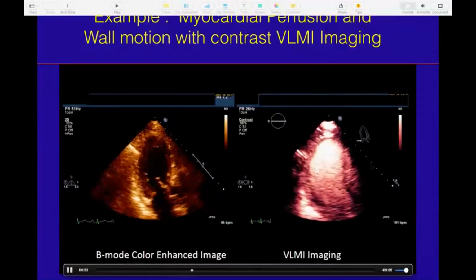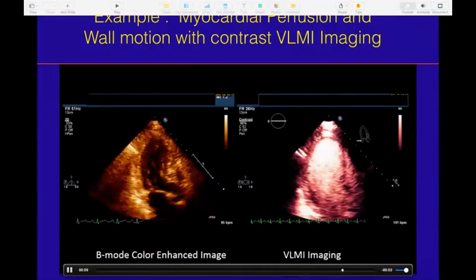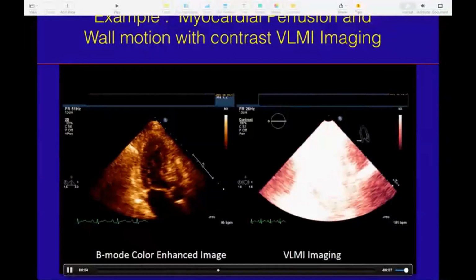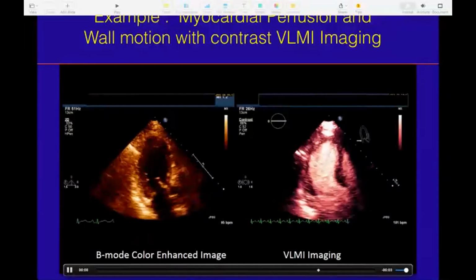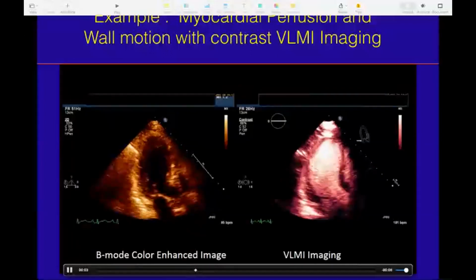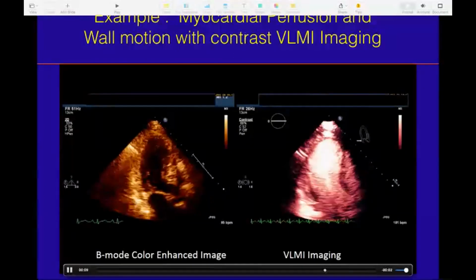And then when you dial that up to exercise echocardiography, where there is hyperemia, the myocardial blood flow filling up should happen even faster, maybe in about 2 or 3 seconds. A delay in that fill up would suggest that there is exercise-induced ischemia. So using very low mechanical index imaging interrupted with a high mechanical index flash and observing the replenishment is a way to actually delineate microvascular integrity.